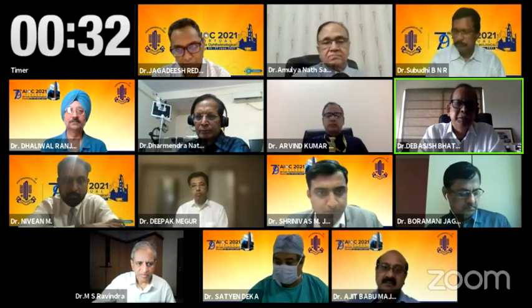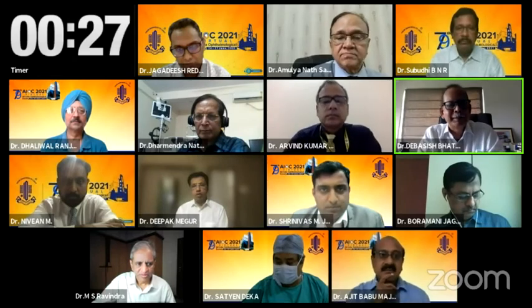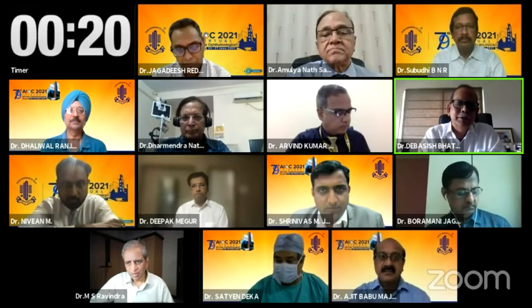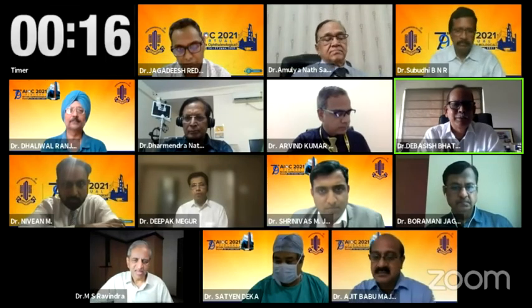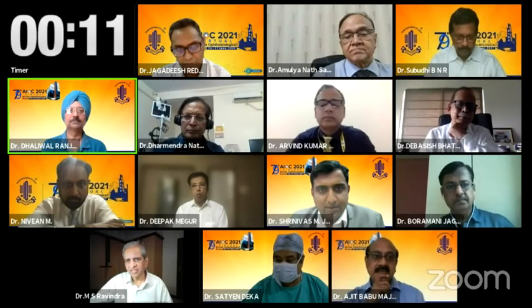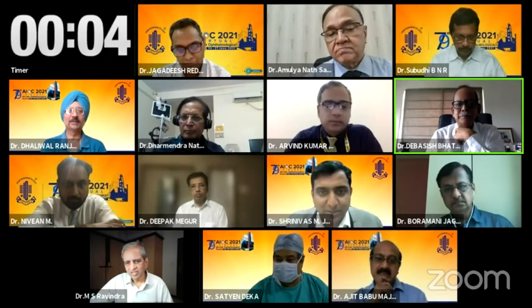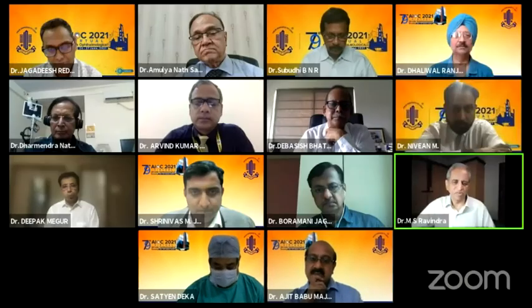Oh, yeah, it's HPMC, Srinivas. But I would remind everybody here that Dr. MS does it so well that you must remember it's attached to a syringe, and he is constantly putting in viscoelastic while phaco-fracturing. So it is not as it looks on the video. The only thing is we should not have endothelial damage while touching with the cystitome. That's why it has to be tried by experts only. Yes, it's HPMC all the time. HPMC is the one which protects maximally.